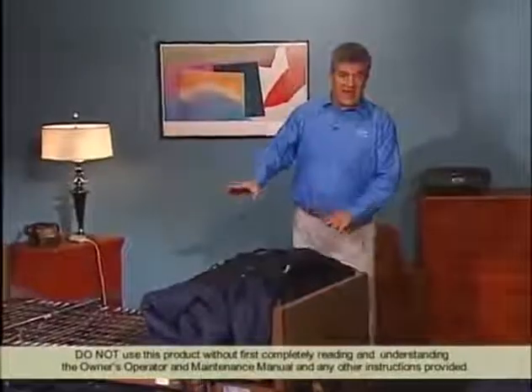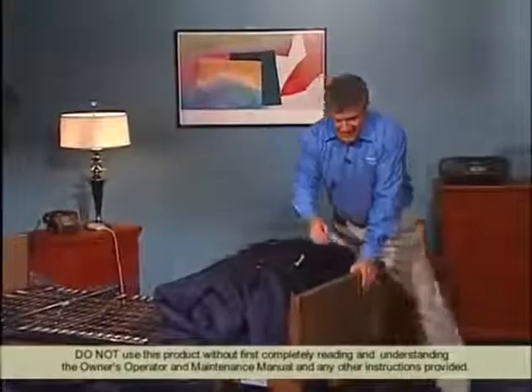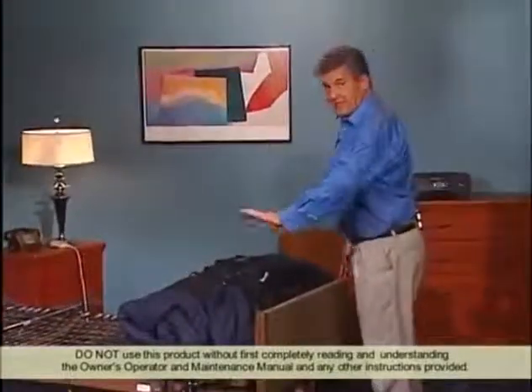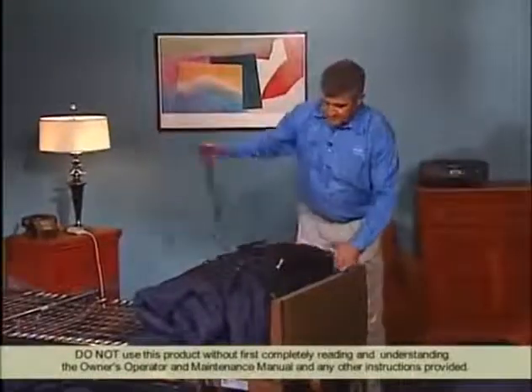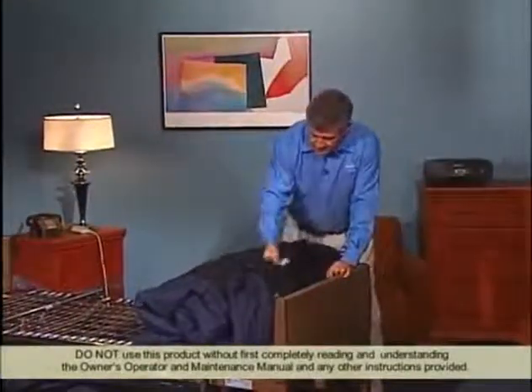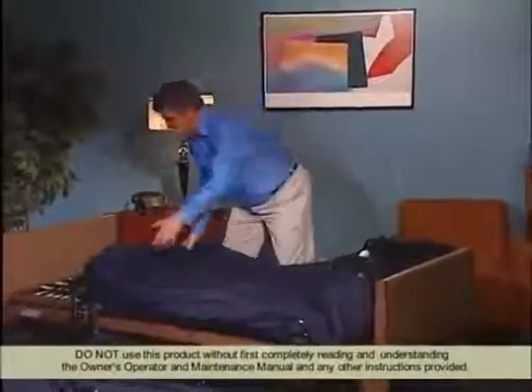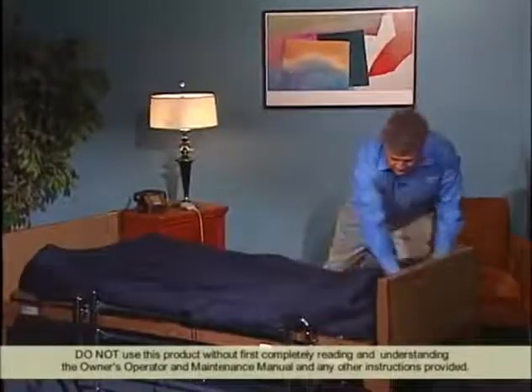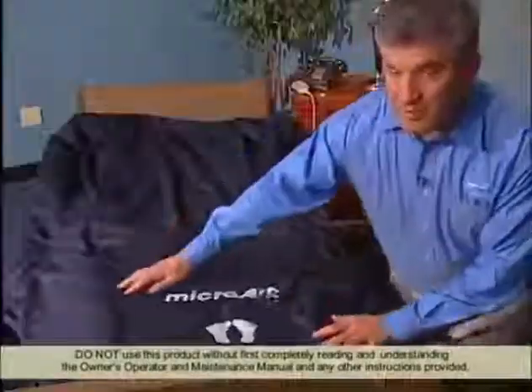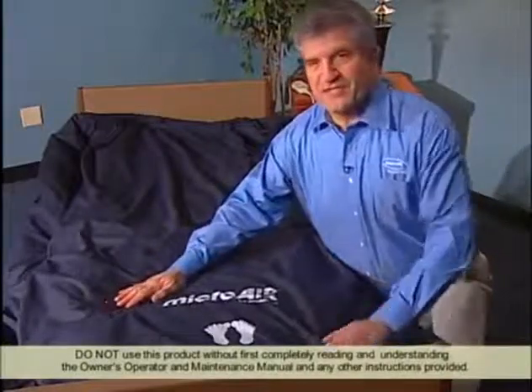When you put it on the bed, make sure that you have the air hose on the left side of the bed. That is the left side as you stand at the foot section of the bed. Undo the straps and unroll it. Notice we do have the foot end labeled on the mattress itself, which makes it somewhat foolproof as far as how it goes on the bed.